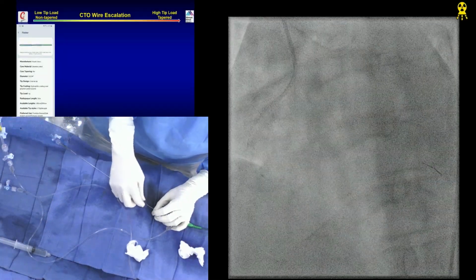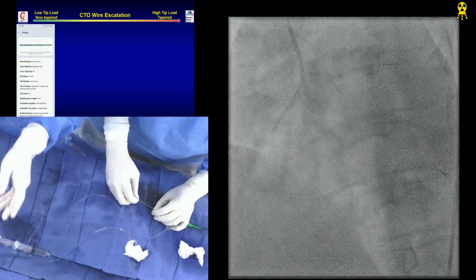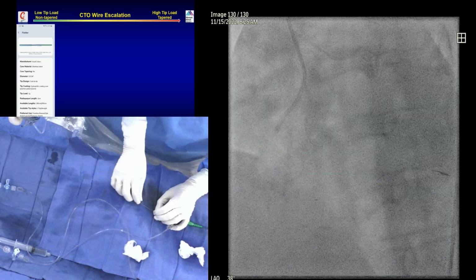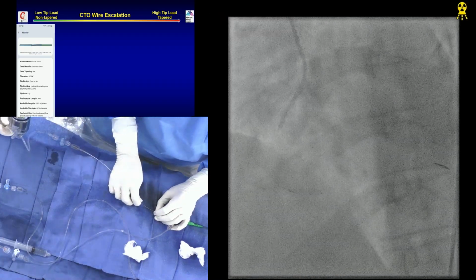We are just at the bifurcation and not going distally. Yeah, right there, good. You can dilate here. You see that? Because there's no lesion after that. Get the Fielder ready. Sometimes it is a good idea to struggle a lot more.